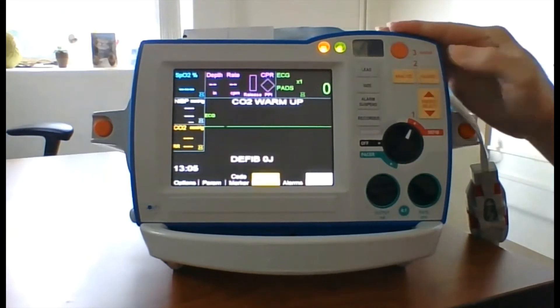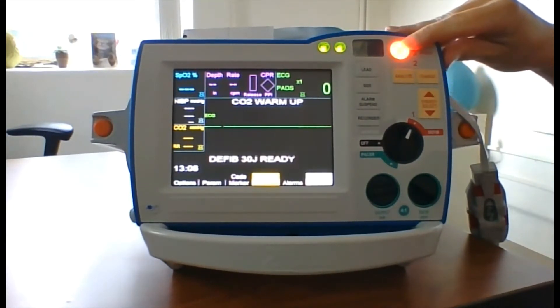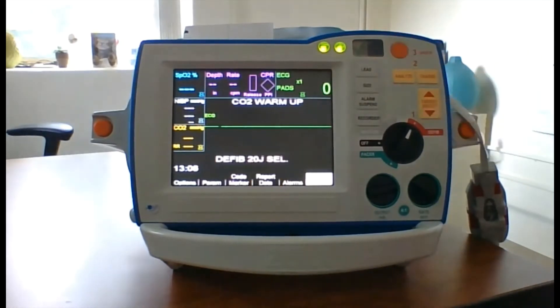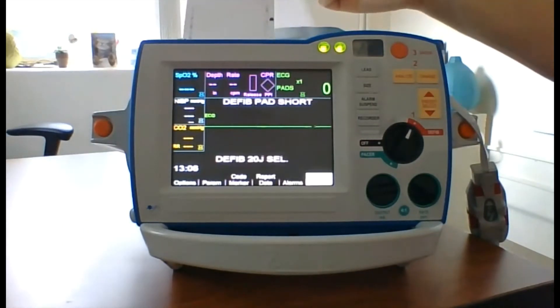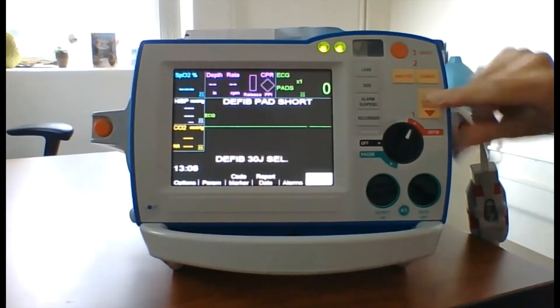Then hit the charge button. Once the shock button is illuminated, hit the down arrow on the Energy Select button to disarm. The recorder will start to print. Then hit the up arrow on the Energy Select button to go back up to 30 joules.